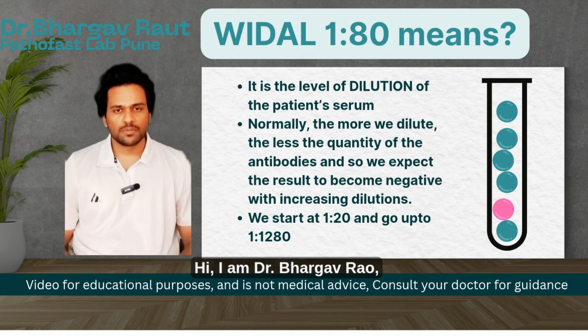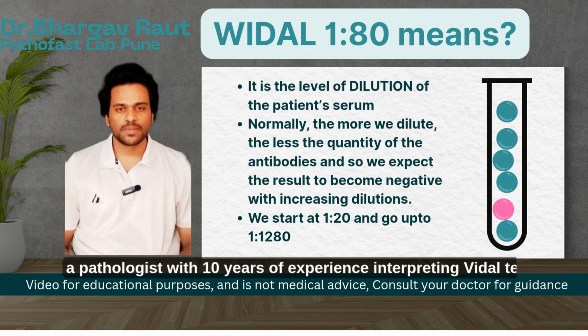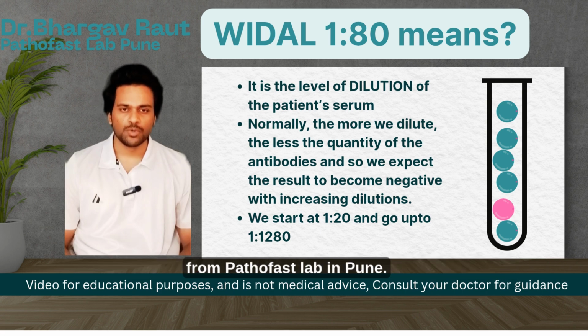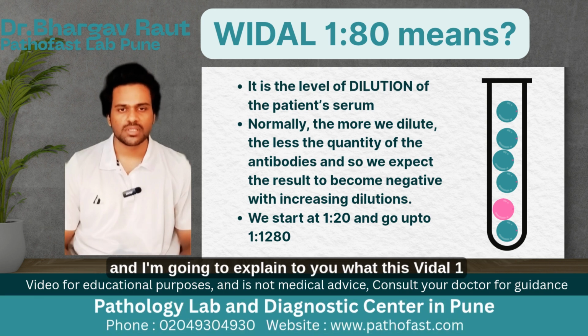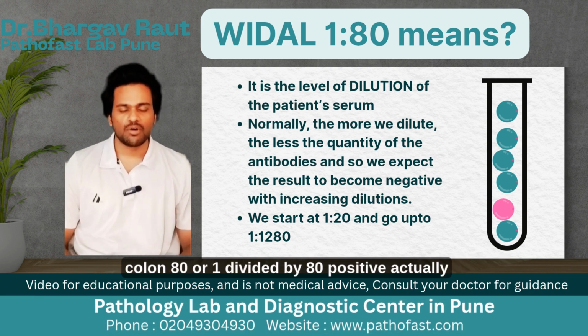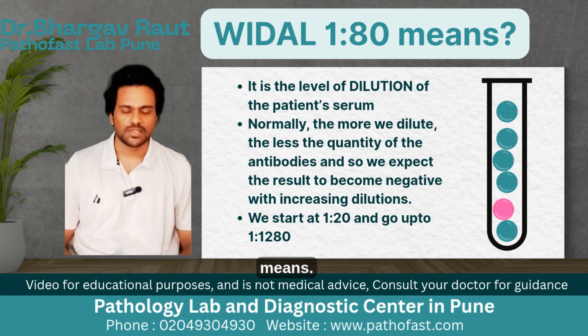Hi, I'm Dr. Bhargav Raut, a pathologist with 10 years of experience interpreting Widal tests from Pathofast Lab in Pune. I've interpreted hundreds, maybe thousands of Widal tests, and I'm going to explain to you what this Widal 1:80, or 1 divided by 80, positive actually means.